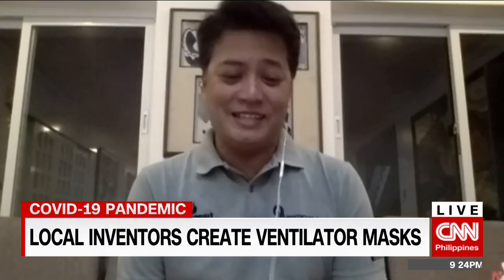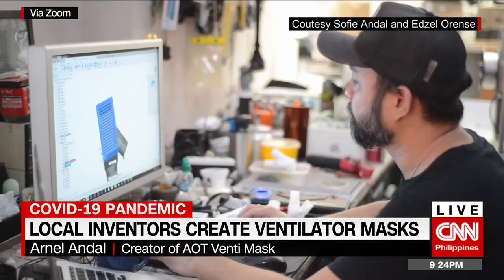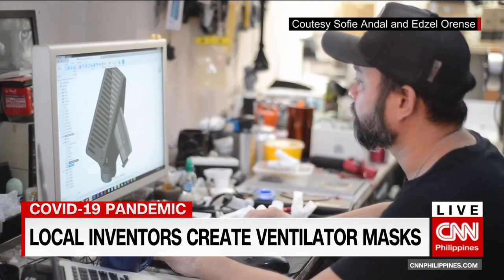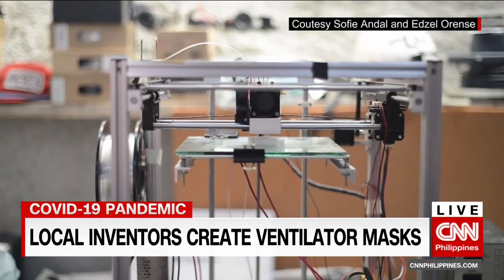Assembling these masks is not easy. How much time does it take to put all of these elements together? We made two masks. The VentiMask takes four hours to 3D print the fittings and about six hours to assemble each mask. And the AO Healthcare Mask takes 10 hours to 3D print and about seven hours to assemble.